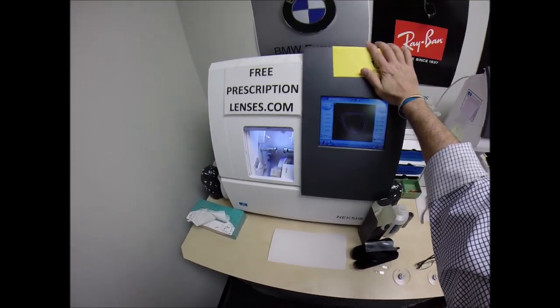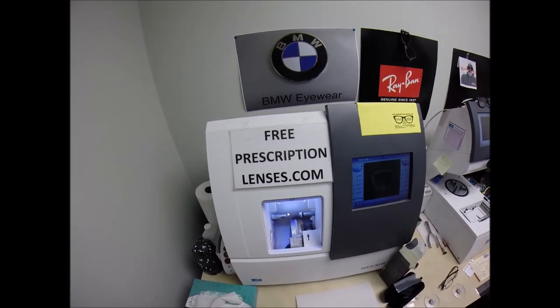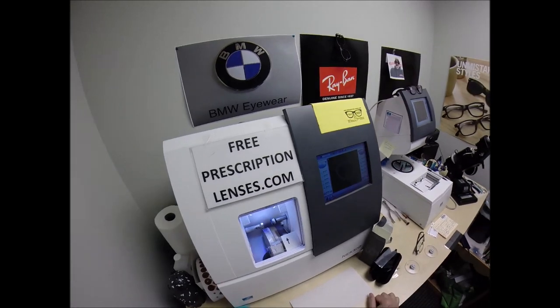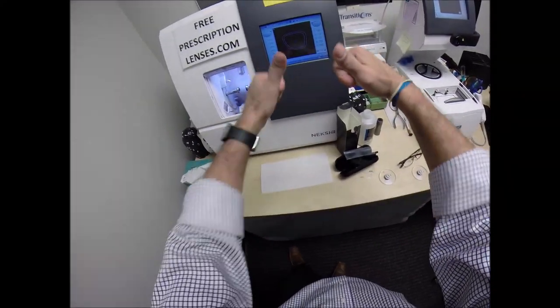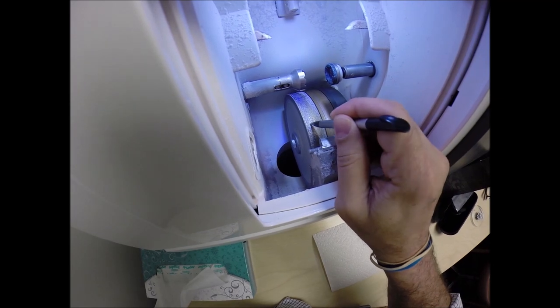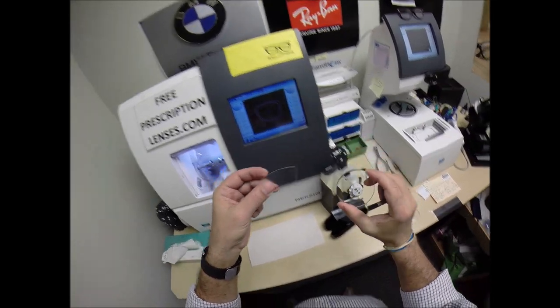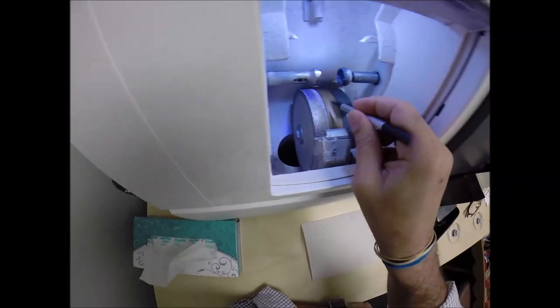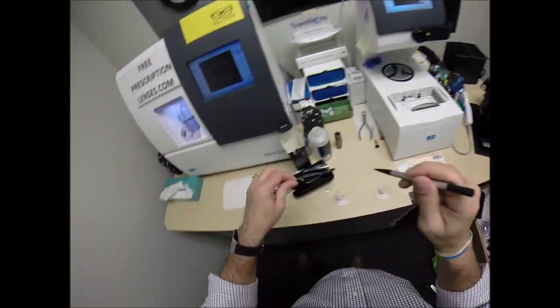This is the edger — this is what's going to do all the work while I run my mouth. It costs $40,000 and weighs 200 pounds. The actual cutting wheel is this diamond-crusted wheel — it's going to act like a heavy-grit sandpaper to grind away your lens from this size down to this size. This wheel in the center with that channel — that little bevel — is what's going to put the V-shaped bevel onto the lens so it stays inside the bevel of the frame.